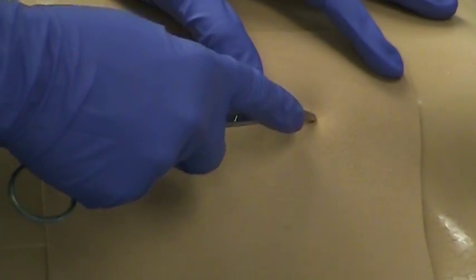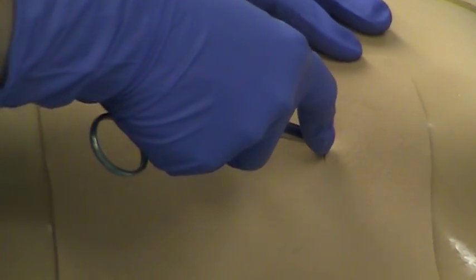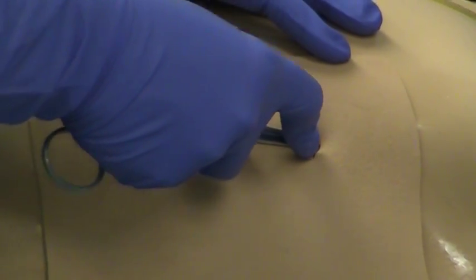We use 2 Kelly clamps, one to clamp the tube. Once you get the tube in, it will start draining immediately, and so you don't want to have it draining all over you and everything else while you're getting it connected. The other clamp we initially use to help us do that tunnel technique. So we go through our incision, feel our rib, and feel to go over our rib.